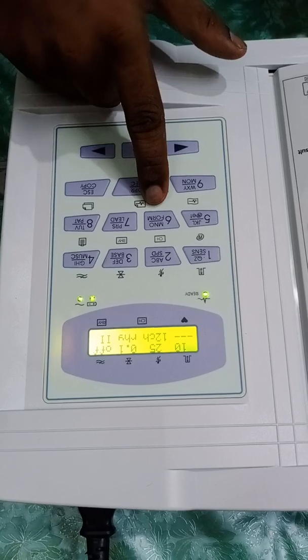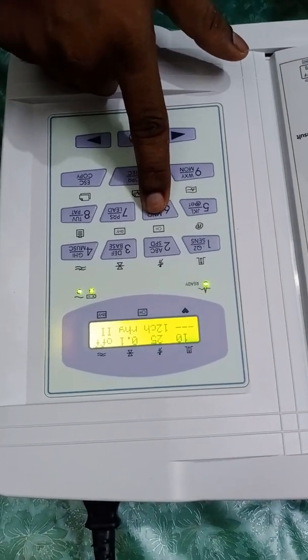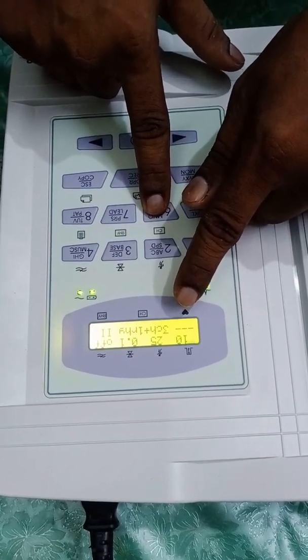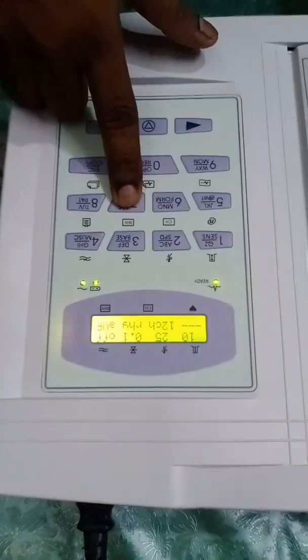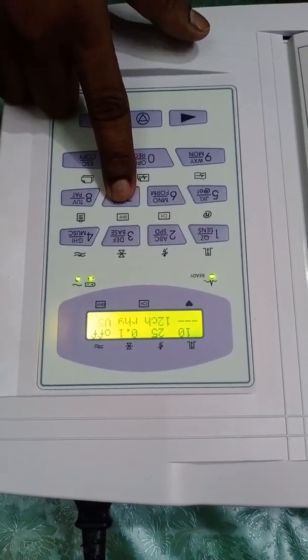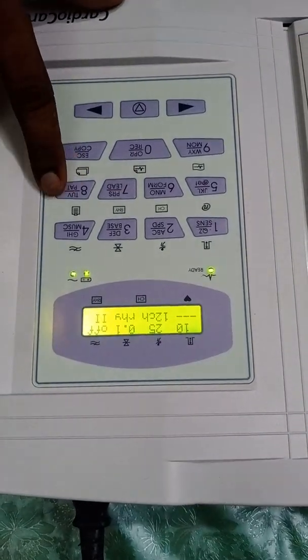The sixth option is the channel changing option. You can notice it cycling through 12 channel, 1 channel, 3 channel plus 1 rhythm, and 6 channel. I have kept it at 12 channel. The seventh option is the rhythm changing button, which you can use to change the rhythm lead. I have kept the rhythm on Lead II — that is fine.